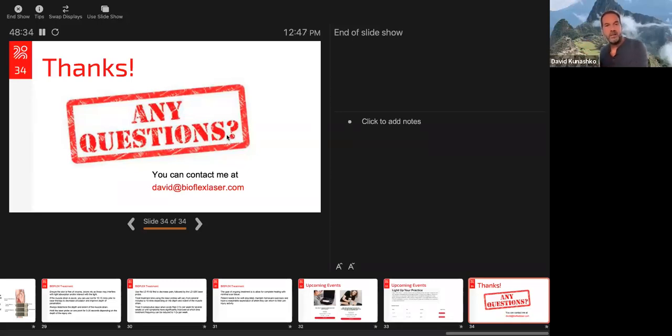Can it be used as preventative on a thumb strain for a reflexologist? Oh man, I feel sorry for reflexologists. I've had it only done once. I liked it, but it was painful, and I could see why your thumbs might have an issue. Yeah, in fact, if you were to pre-treat your thumbs, I would treat them every day or every other day. You're going to help with reducing potential arthritis and also keeping the general health of the tissues. But at the end of the day, if you do that every day, you're still going to have problems, unfortunately.